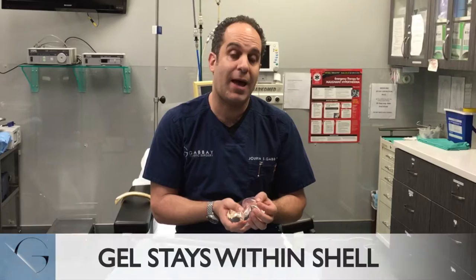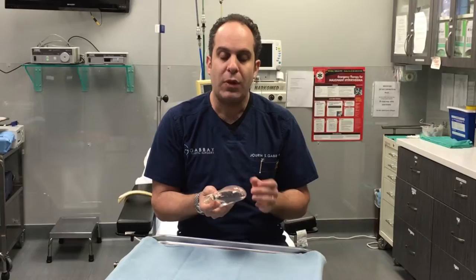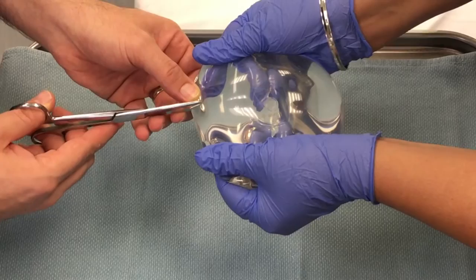What I'm going to do today is actually make an incision in the implant to show you what will happen to the gel when the shell is violated. We're going to make a small nick in the implant to show what happens with a rupture.